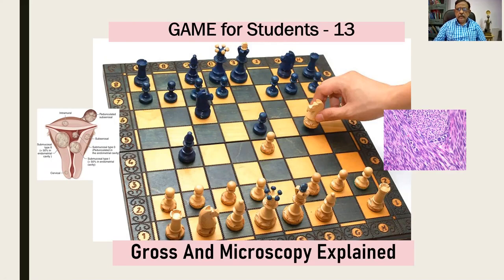Game 13. Gross and Microscopy Explained.